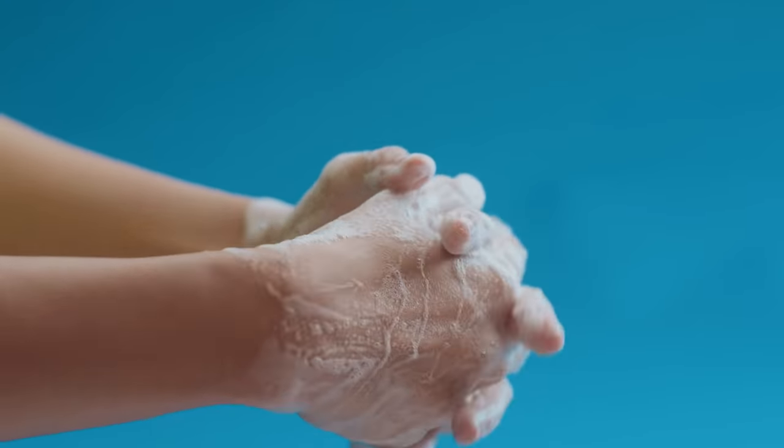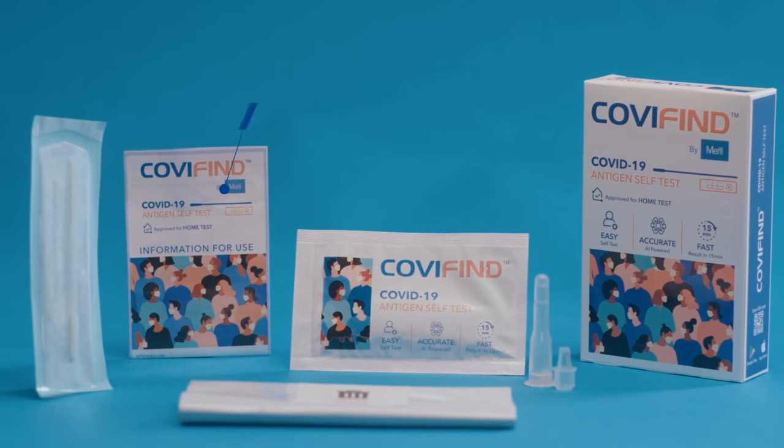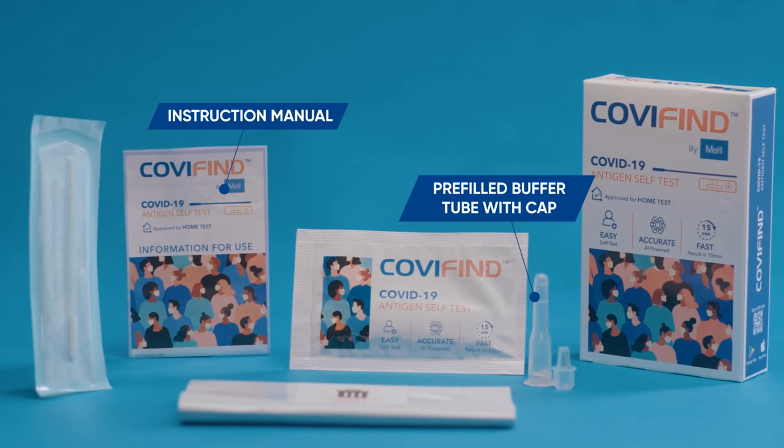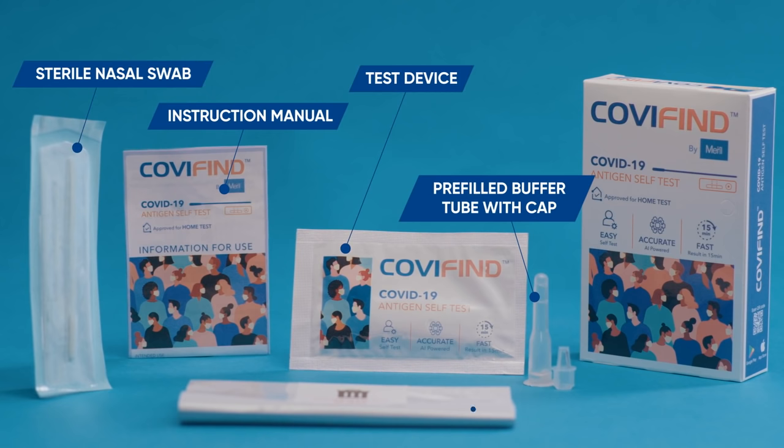The first step is to find a clean surface and wash your hands for 20 seconds. Dry completely. Open the kit and take out the testing components. You will find inside an instruction manual, a pre-filled buffer tube with cap, a sterile nasal swab, a test device, and a disposal bag.